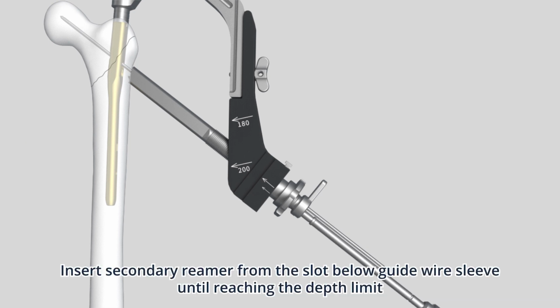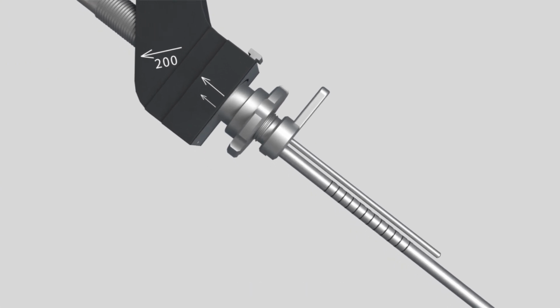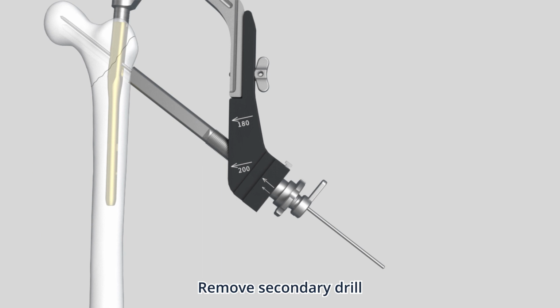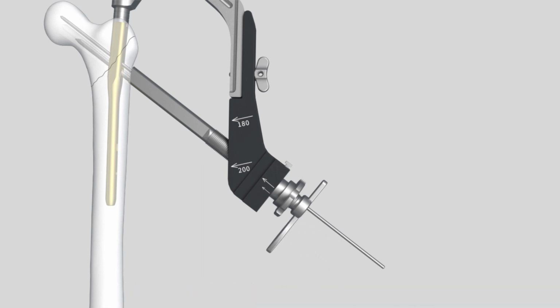Insert secondary reamer from the slot below guide wire sleeve until reaching the depth limit. Switch to the secondary drill. Drill into the femur neck. Use the drill under monitoring. Stop at the target length, which is 5 mm shorter than the previous reading. Remove secondary drill. Insert secondary screw locator into the hole.